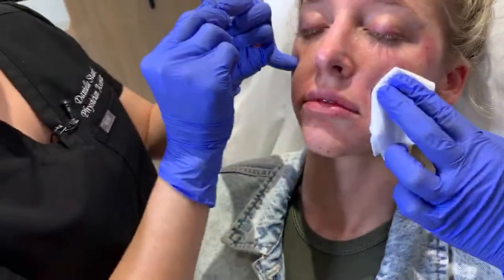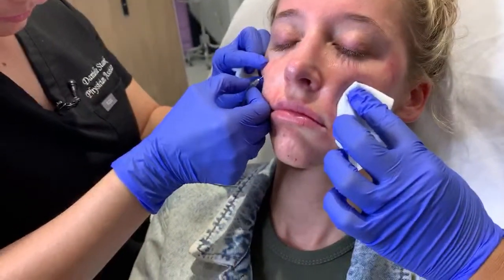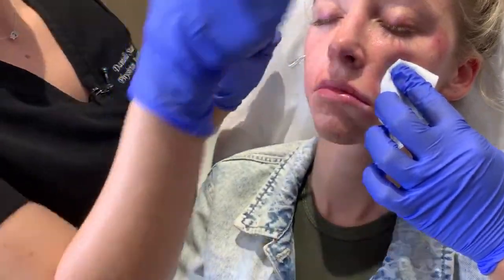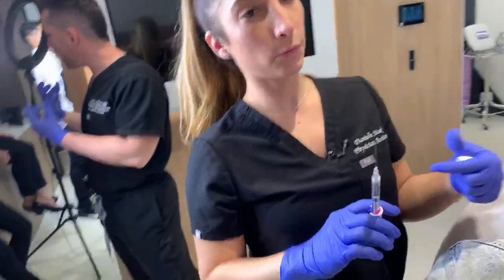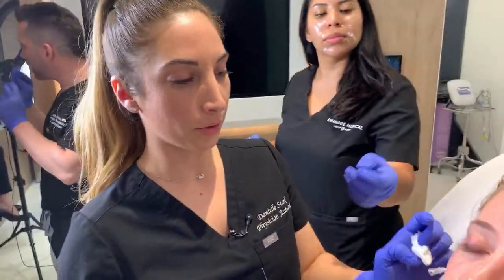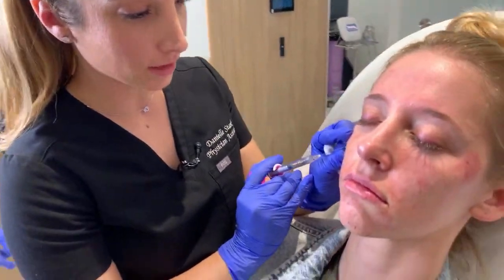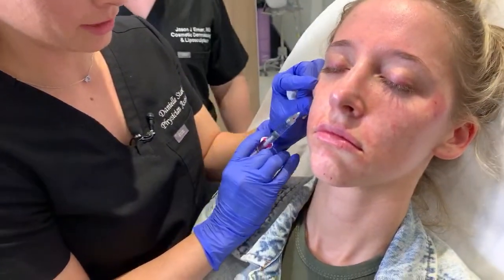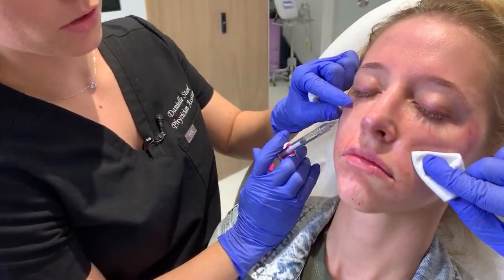Look, this is what's gonna make it look better. Not that you need it, but for one, it's just gonna improve it. Right now, you do have to look at the way your face is shaped. It's naturally good. We use a bigger filler, more natural, so your volume occurs. Go ahead and pull a little bit. The topical numbing is really strong, especially right now with the lights on. It's definitely warm, and you're gonna feel the movement. The topical numbing spreads around the eyes, so you numb so well.